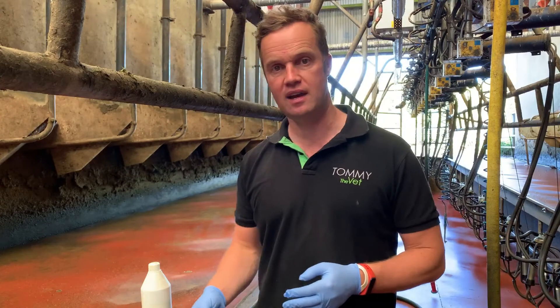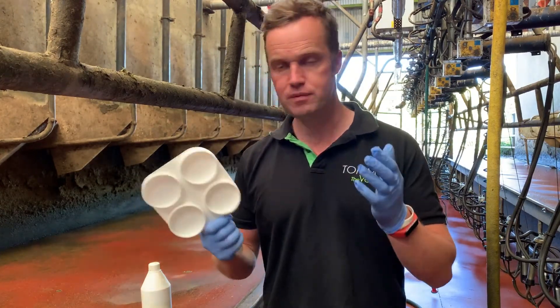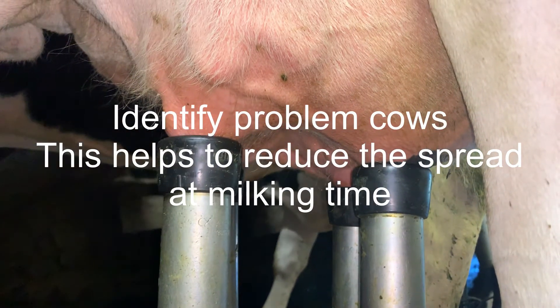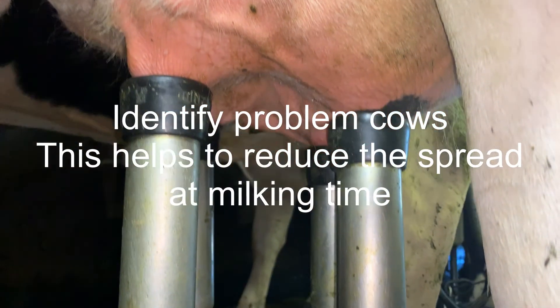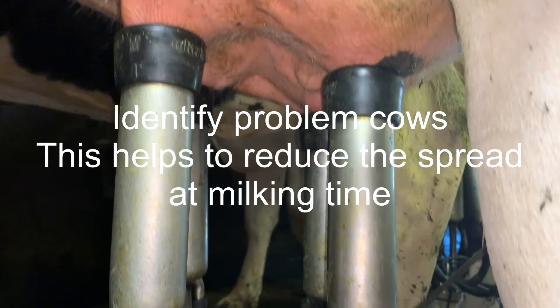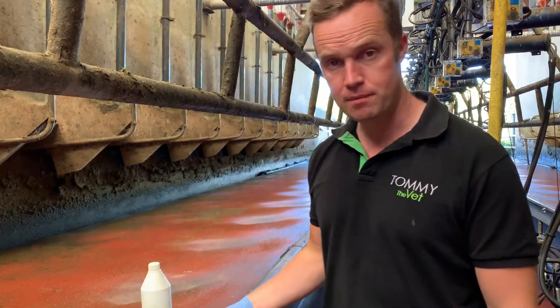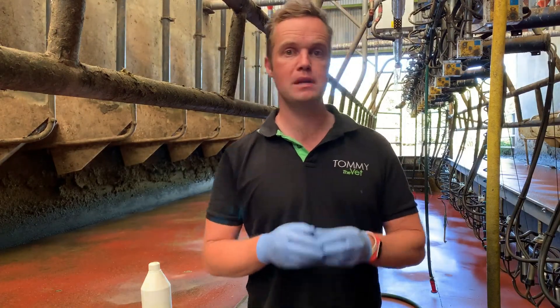The CMT test is a tool every dairy farmer should get comfortable with. I've been using it this morning for the first time in a few months — it's uncomfortable at the start, but once you get used to it, it becomes very easy. Obviously between cows you need to give the paddle a good clean and wash. The California Mastitis Test is a very valuable tool as part of our milk quality control.